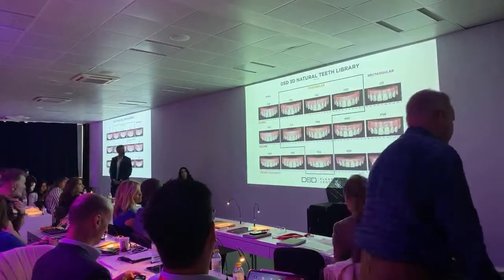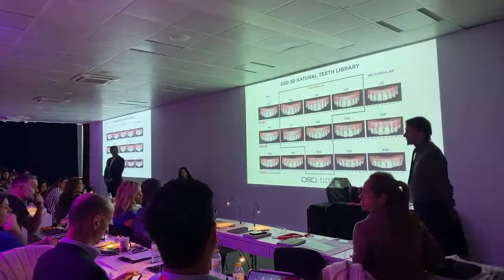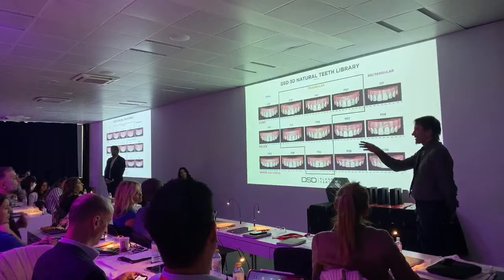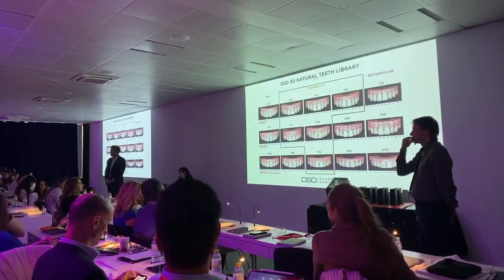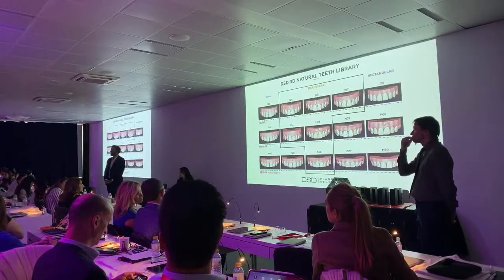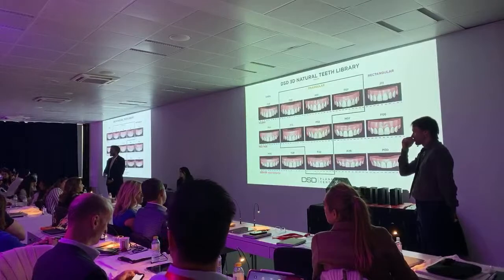Let's say you're on aligner 40 and you were supposed to go to 50 whatever. If you scan your patient at aligner 40. No, but I want to know before I ask for a case. Sometimes I can ask for a light, not for a full. You tell me, okay, you only need 10 aligners. Yeah, that says on TPS.